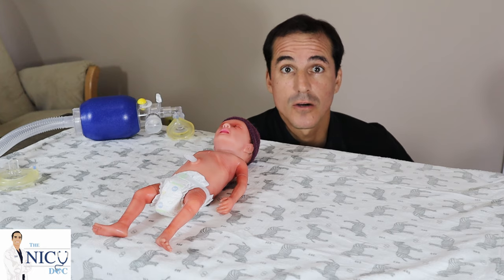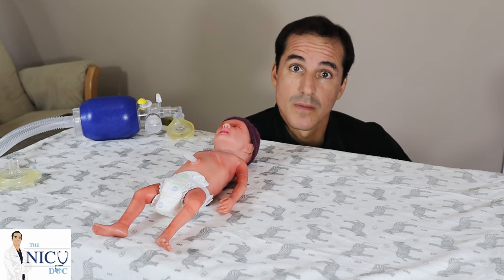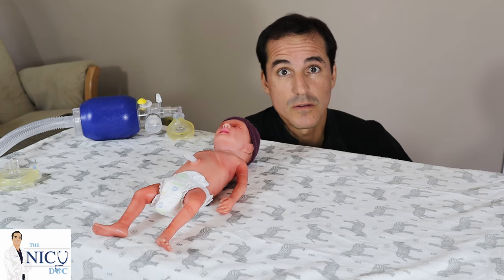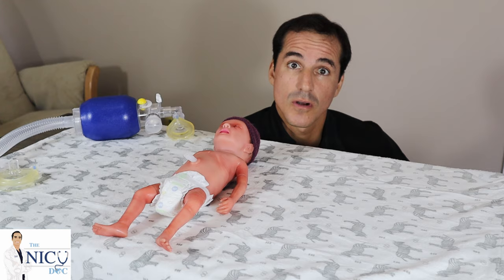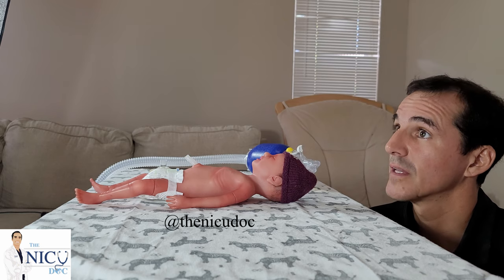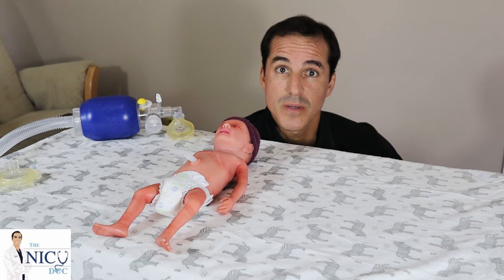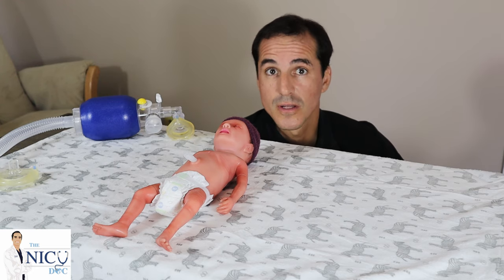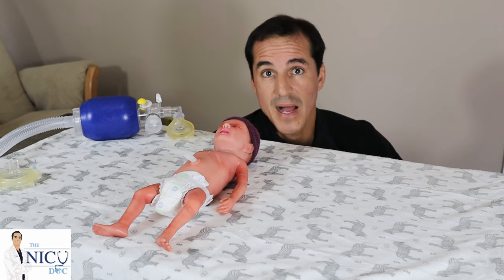Today we're going to be talking about bag mask ventilation, CPAP versus PPV. It's really important before we start that you know the type of equipment in your hospital. You can use an anesthesia bag, which will deliver oxygen as well as pressure. You can use a T-piece, which will also allow you to deliver oxygen and pressure. Or you can use a self-inflating bag. The self-inflating bag will not be able to deliver 100% oxygen like the other two.